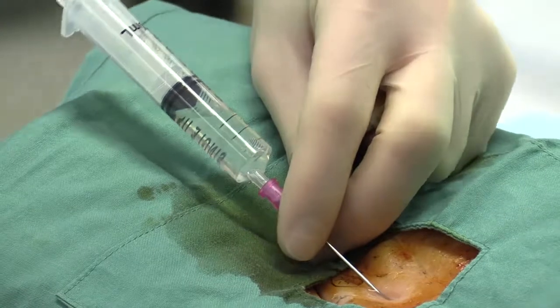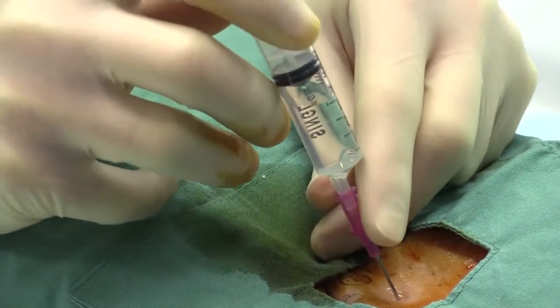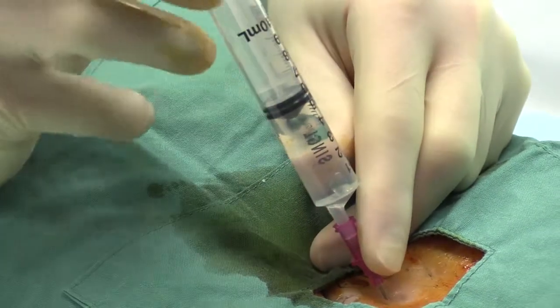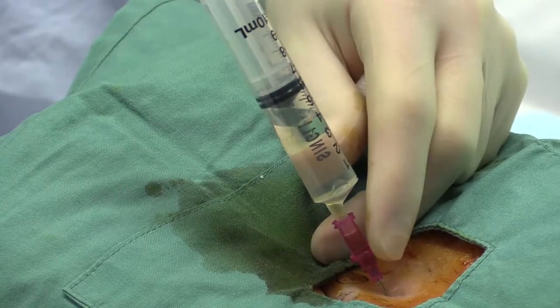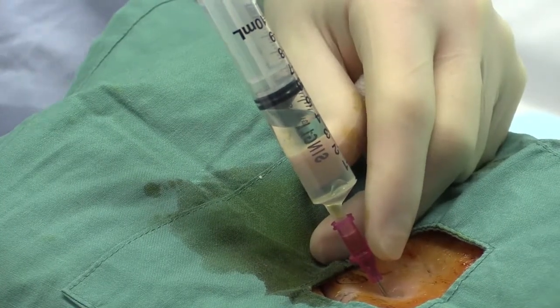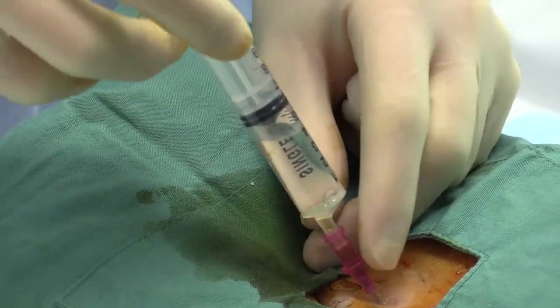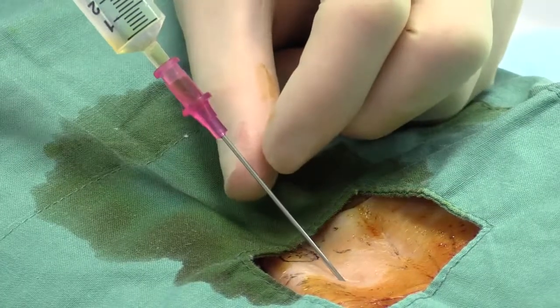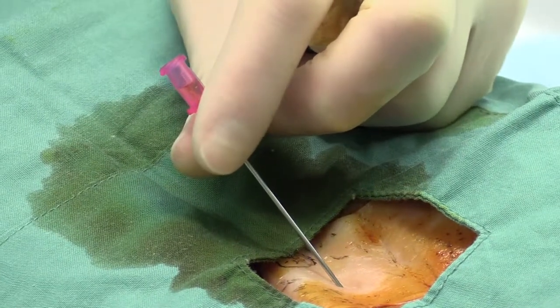The other thing you've got to look out for is bile, which would look like a green or yellowy staining of the fluid. And then clearly you all know what blood looks like, and if that is the case, one pulls back on the needle and repositions, and the syringe is flushed.